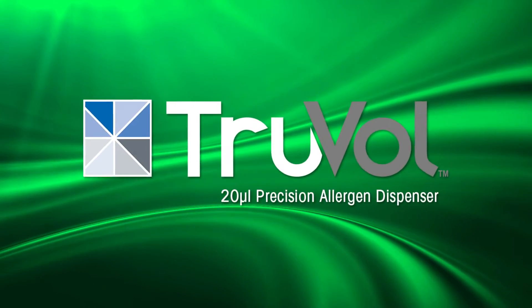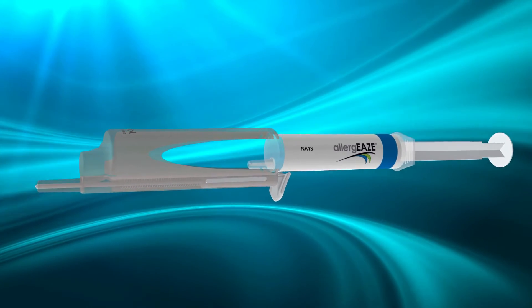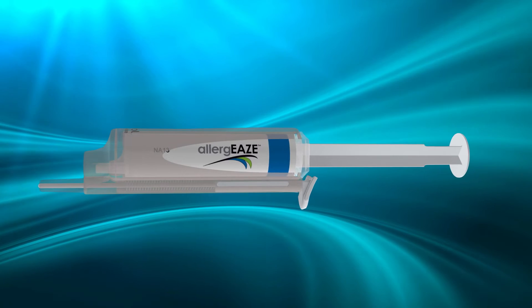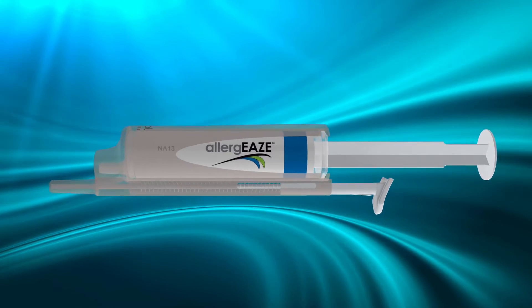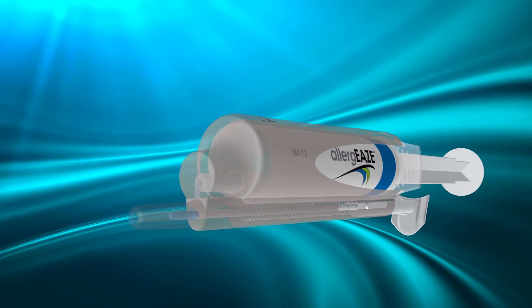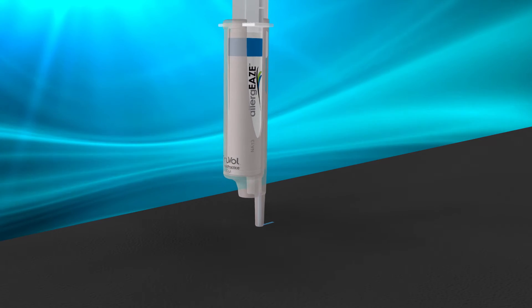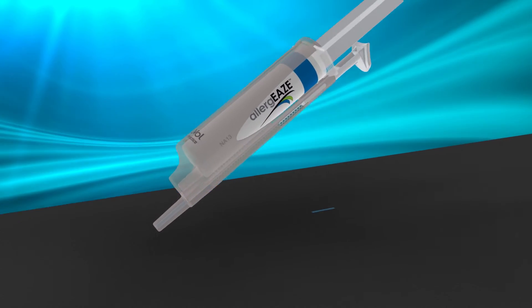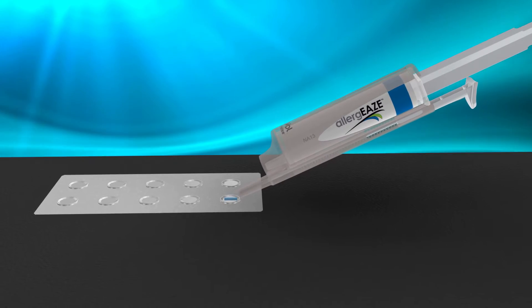Here's how easy it is to use Truvol. Simply load your allergen syringes into the Truvol Precision Allergen Dispenser. Unlatch the Truvol plunger and fill the Truvol metering chamber with allergen by pressing the allergen syringe plunger, and wipe the excess allergen from the tip to ensure proper dosing. Apply the allergen into the desired chamber by completely depressing the Truvol plunger.